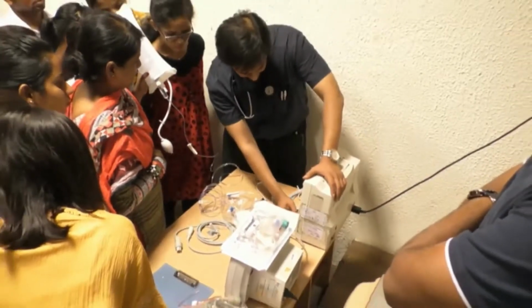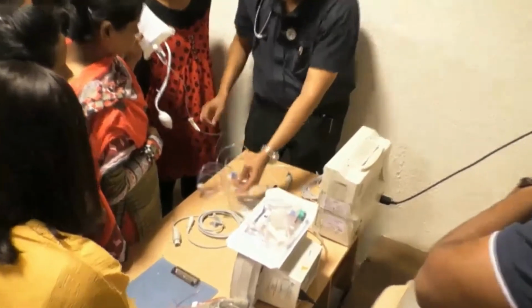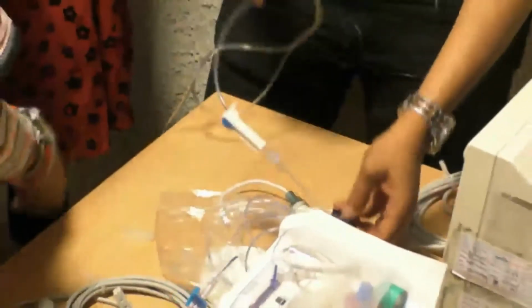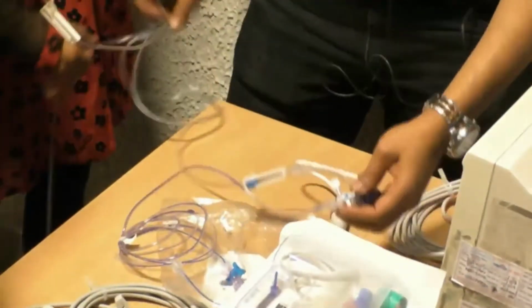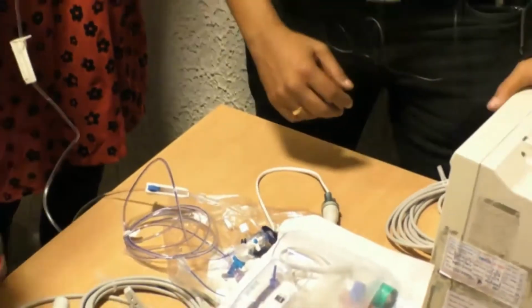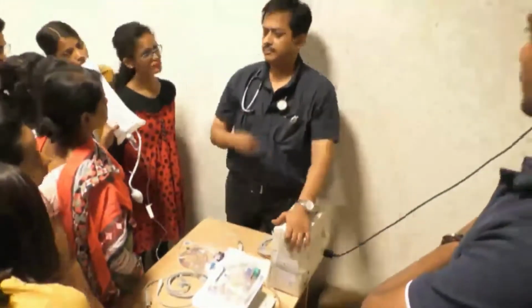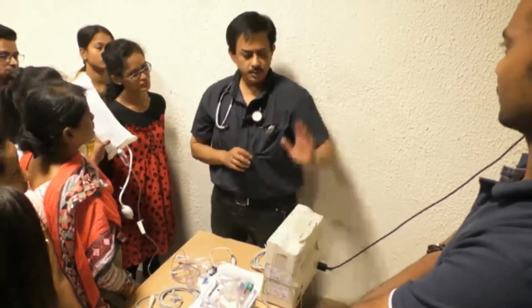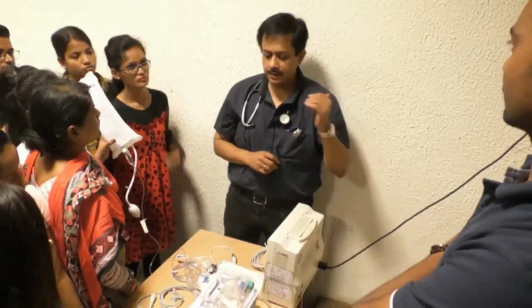Okay. Now suppose this is open here, this is open to the patient. This is not connected. Now let us say an arterial trace is coming, but suddenly there is a change in arterial pressure, a sudden drop. Or you see the curve which was coming, its morphology has changed. Then what do I do?